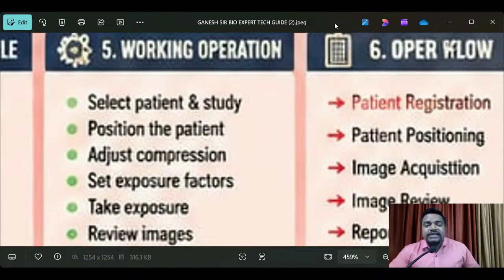So these are important when you give user training on the medical equipment, on a daily, weekly, or monthly basis as per schedule. If you provide clear user training to the customer and the technician, the equipment issues reduce. When handled properly, most complaints will reduce, and it maintains the reliability of our services. I hope that is very clear now.